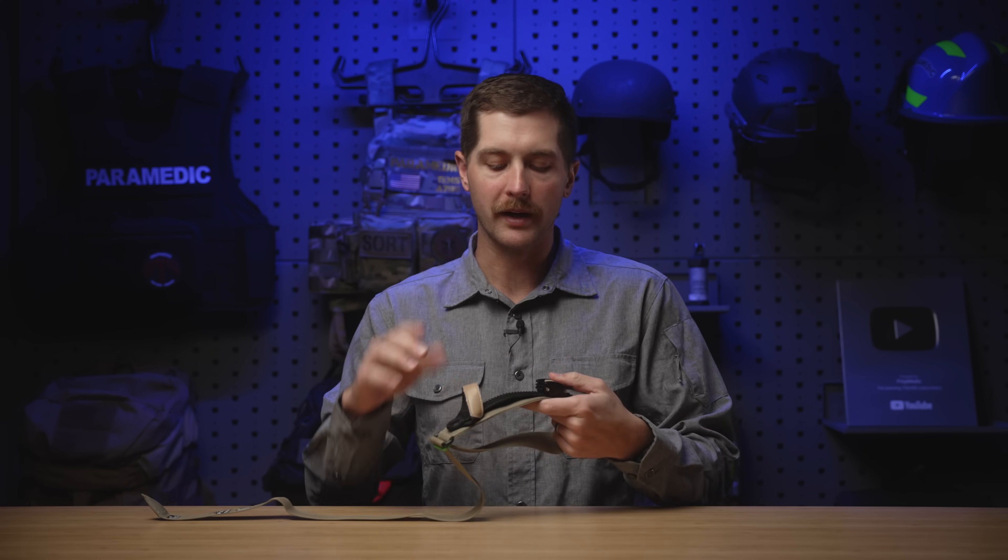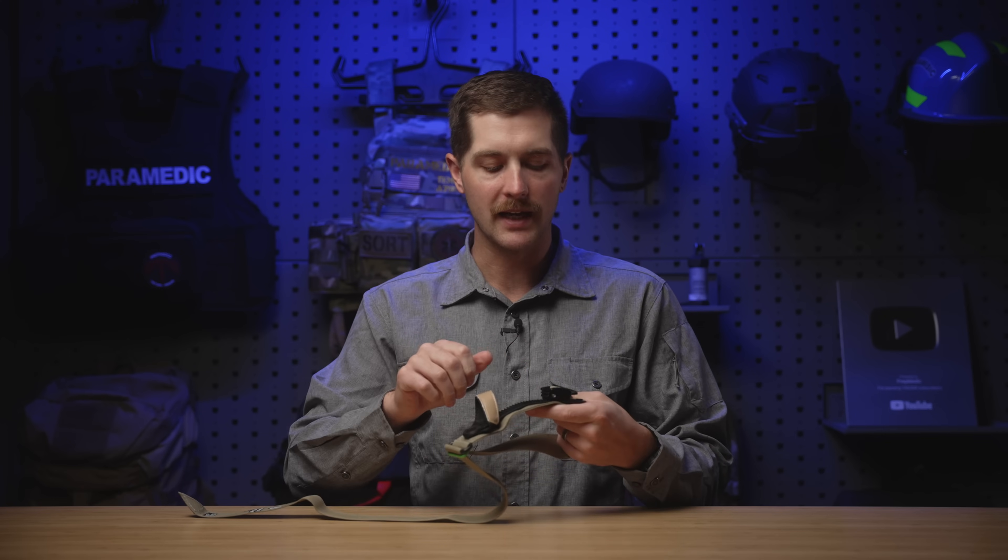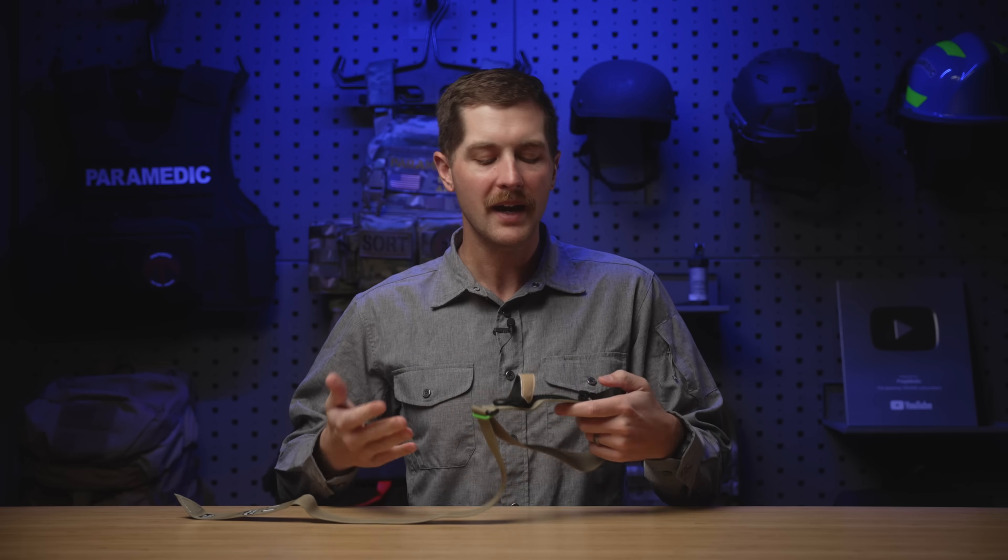Similar to a snowboard binding, this does have a risk of getting gummed up and not ratcheting as it goes down. What I've noticed with snowboard bindings is that they can get a ton of snow, dirt, and grime in them and still work relatively well. Where I think the failure point is, is if it's grimy and you're trying to get it to release — that can be a little trickier — but that's not as big of a deal on a tourniquet as it is to be able to ratchet effectively.